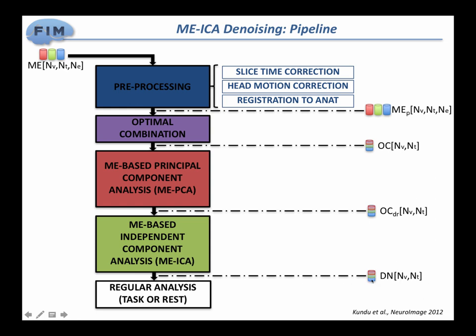The cleaner the data, the more work you have to put into it; the less clean, a little bit less work. But in my opinion, as long as you don't have very precise constraints on spatial or temporal resolution, like really, really big constraints, I think there is no loss in getting multi-echo data and at least getting here. You're going to have improved TSNR, and you're going to recover signal in those areas of dropout. Then if you have the time and the energy, you can go for this, which I recommend too. But you know, I don't see that much loss by actually acquiring this richer data.